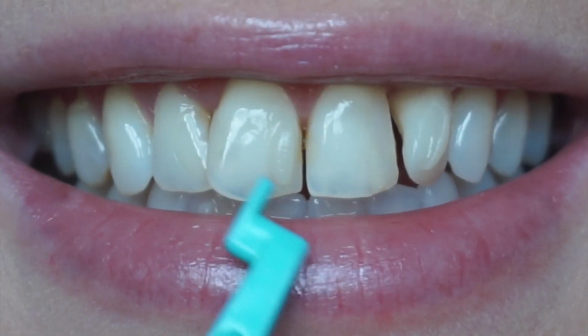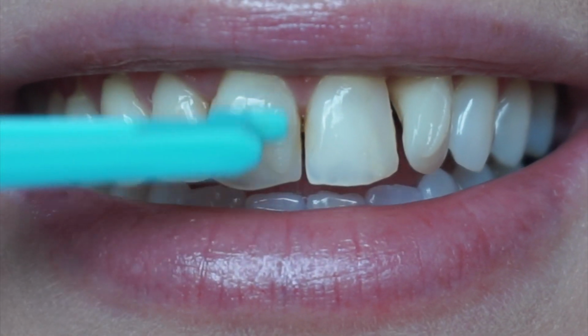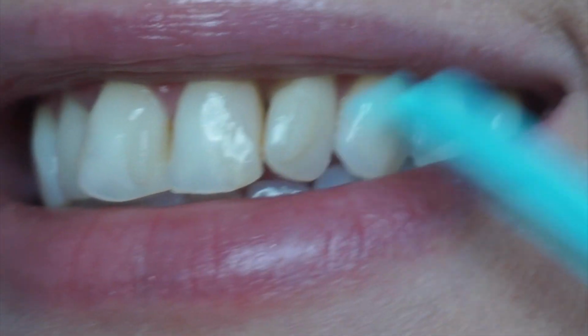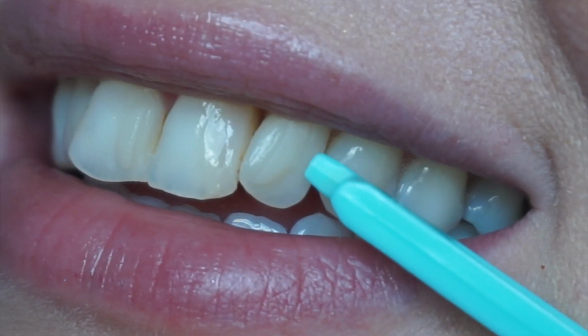Now let's speak about the attachments. I had different attachments until a few days ago when I got my new aligners. The upper ones, she took both of them off and she replaced them with other attachments which she placed in different positions. So these are my new attachments. One is here, see? This blob of white, this line, like that. And one is there. See? This line on the tooth here, that's the attachment. There.